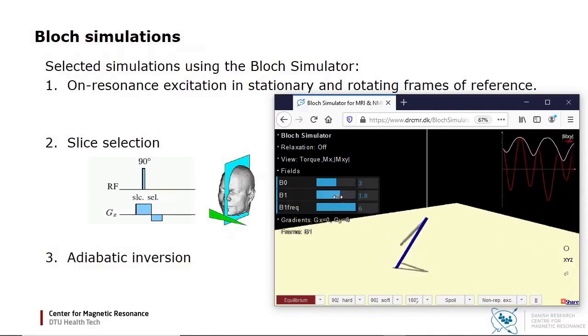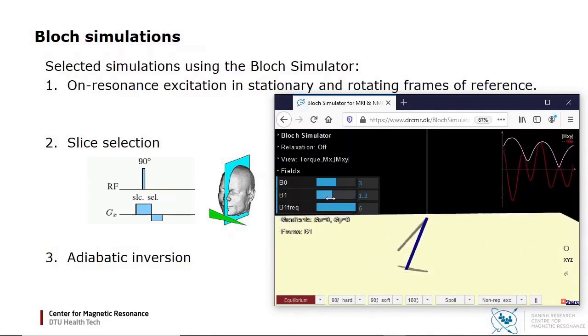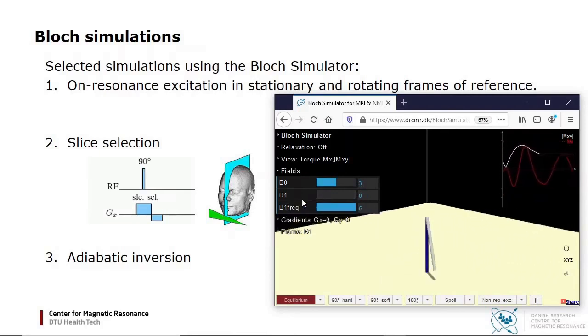The result is an approximate inversion of the magnetization, which at all points stayed close to the effective field vector.